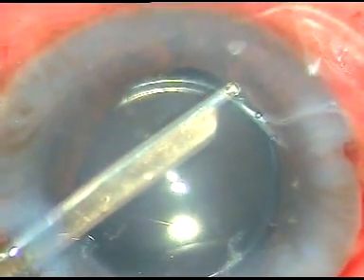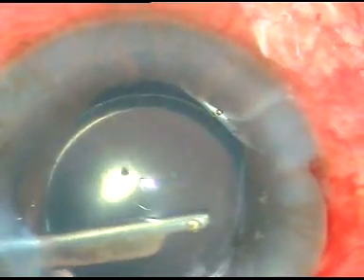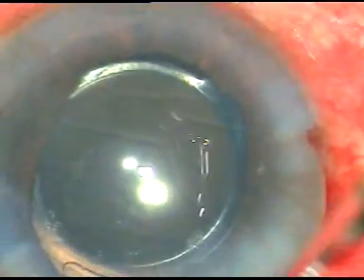So by doing surgery in such cases, we actually treat the cause of the block.